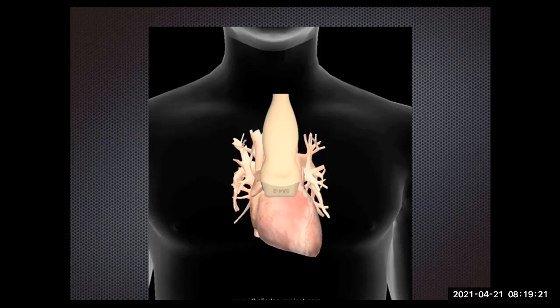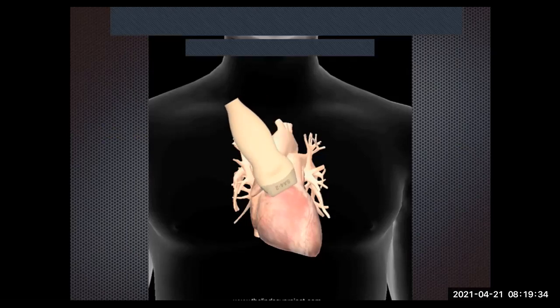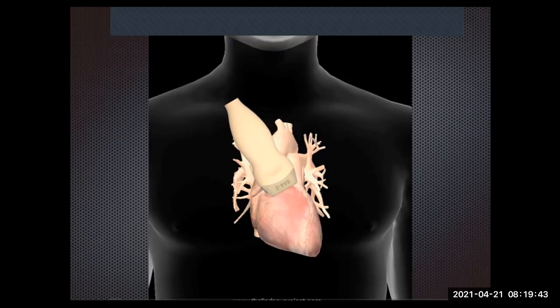You don't need to, but for more advanced users, you may want to actually scroll through the heart to look at different aspects of the heart. So you can tilt or angle a little bit towards the apex, to look down towards the apical region.